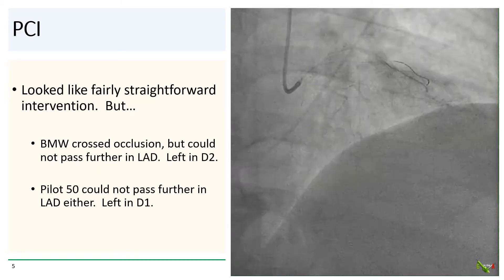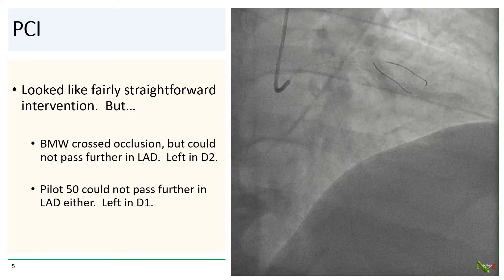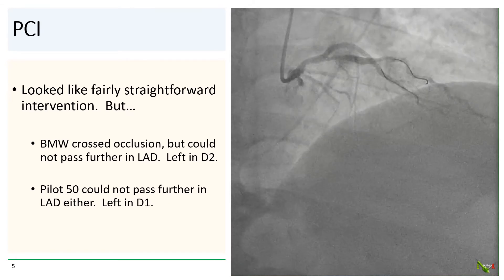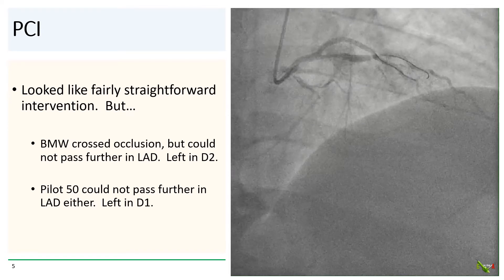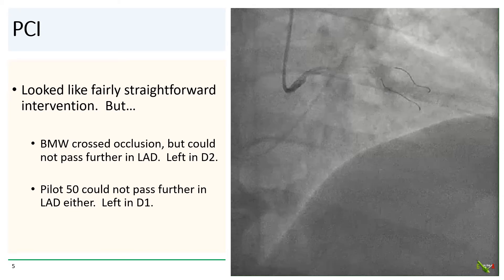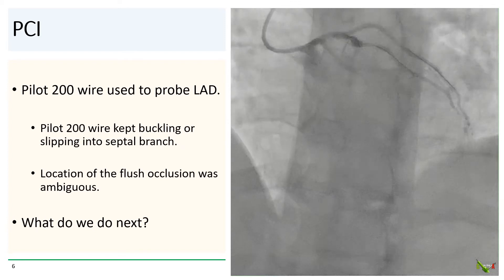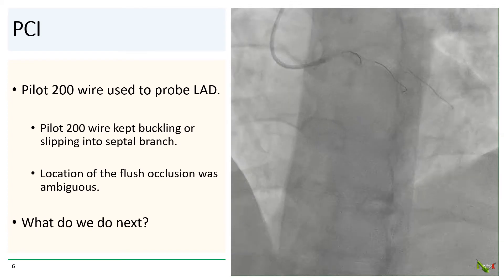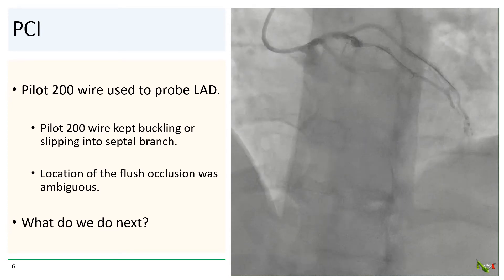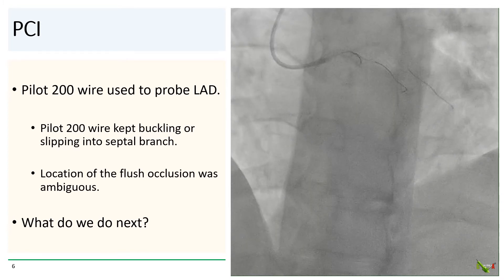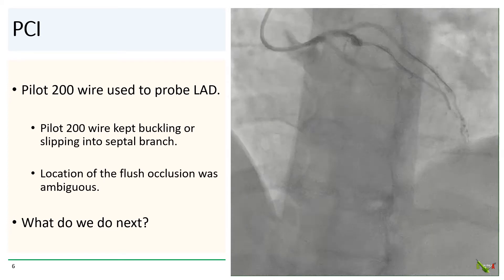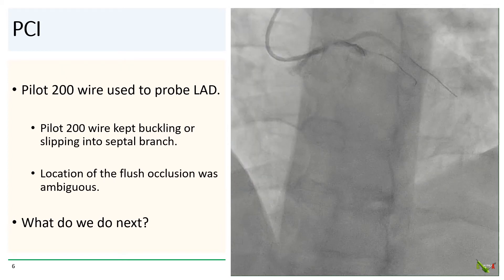We went to work on the LAD in what we thought was going to be a fairly straightforward intervention. The workhorse BMW wire crossed the occlusion easily, but kept being directed into a diagonal branch and could not pass more distally into the LAD, so it was left in D2. We tried a more hydrophilic pilot 50 wire, but that could not pass more distally into the LAD either. We switched to a heavier pilot 200 wire, thinking that the mid-LAD lesion was at least subacute, if not actually a CTO. However, even with the pilot 200 wire, we were not able to enter the occlusion. The location of the start of the occlusion was unclear, and the pilot 200 wire kept buckling or kept sliding into the septal or diagonal branches.